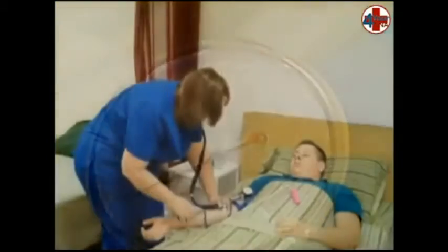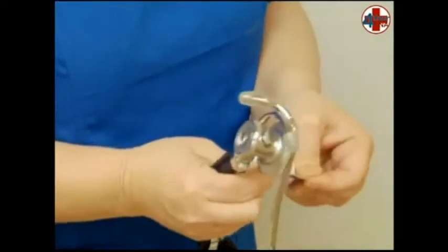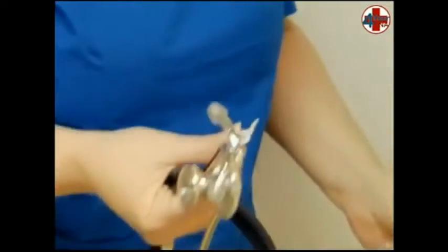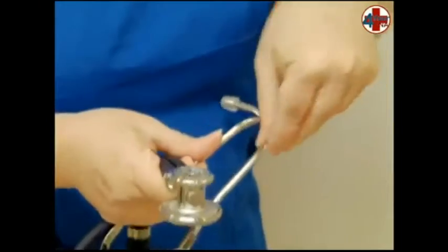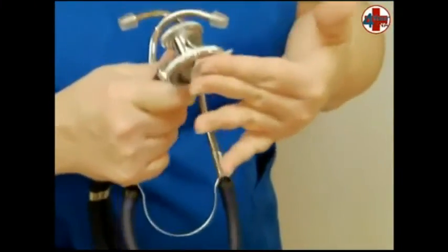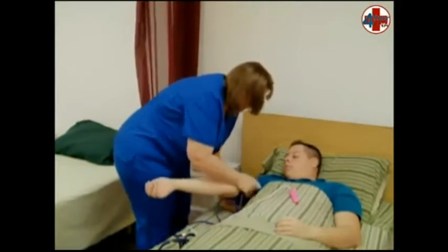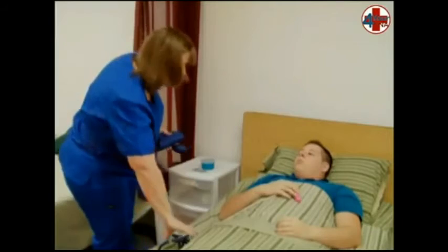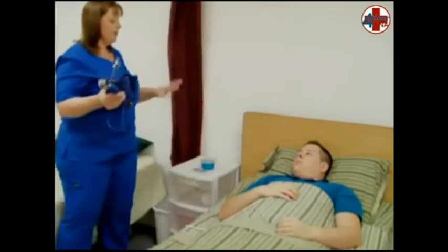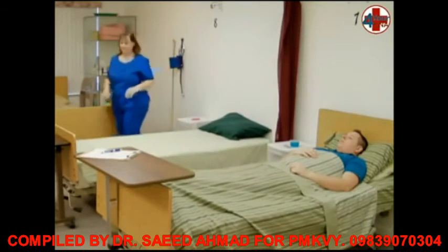When the needle reaches zero, remove the earpieces from your ears. Open an alcohol swab and wipe off each earpiece and the larger diaphragm, then throw the alcohol pad away. You will need to clean the evaluator's earpieces as well. Remove the cuff from the patient's arm and roll it for storage, making sure the cuff is completely deflated. Open the privacy curtain, making sure your patient has his call light, and return your equipment to its storage area.